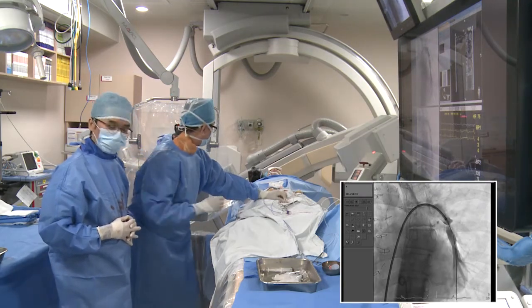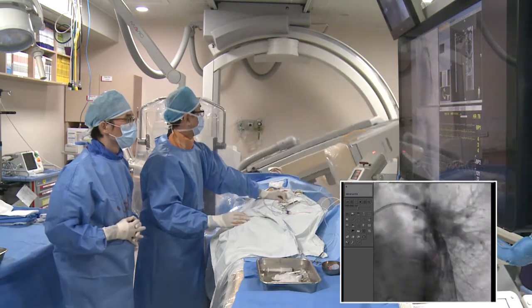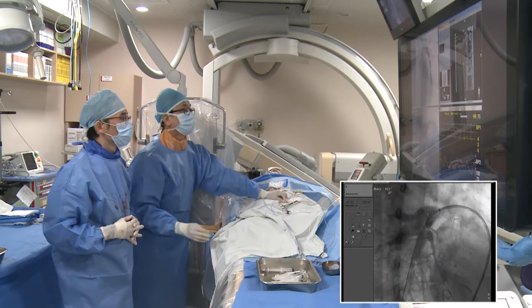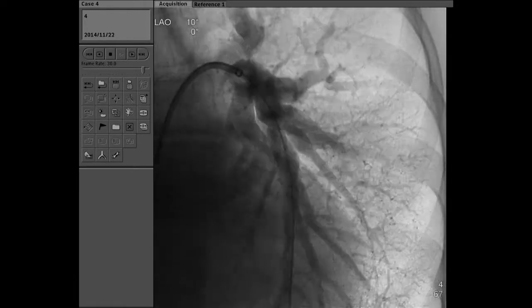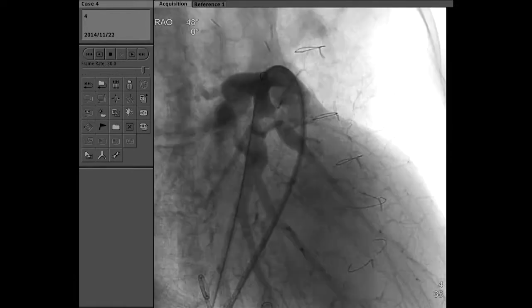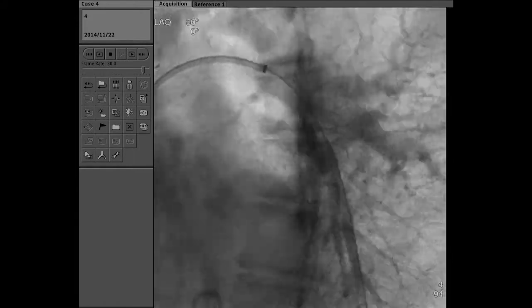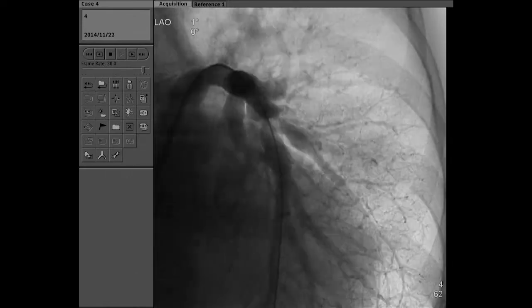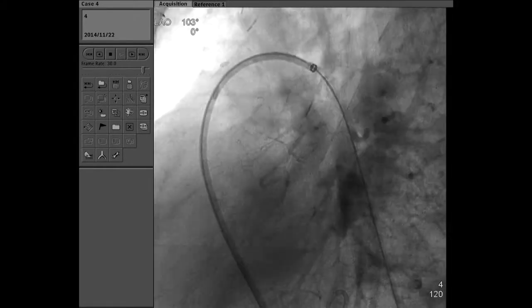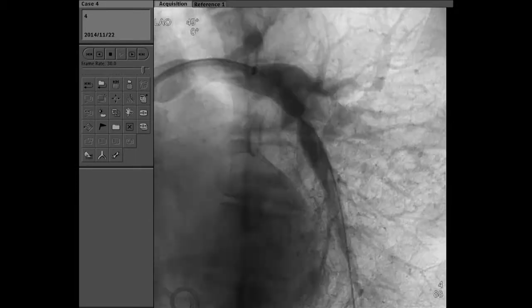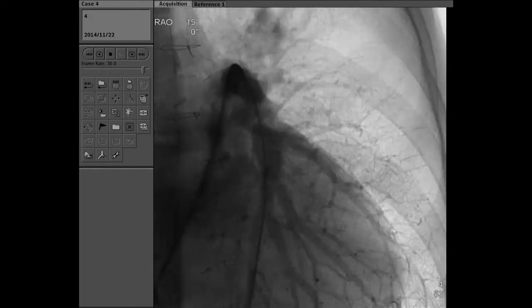We are now performing the 3D rotational angiogram. This used only 40cc of dye for a 38-kilogram patient — just one cc per kilo. We don't need any more angiograms for this patient. We can select all the vessels and dilate with this one angiogram. This is one of the advantages of a rotational angiogram.